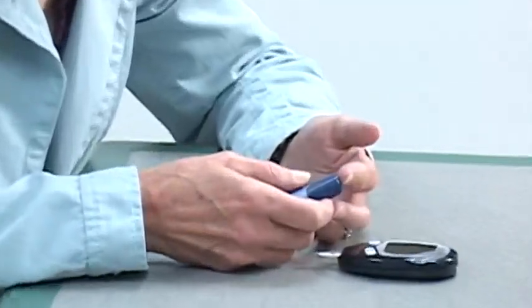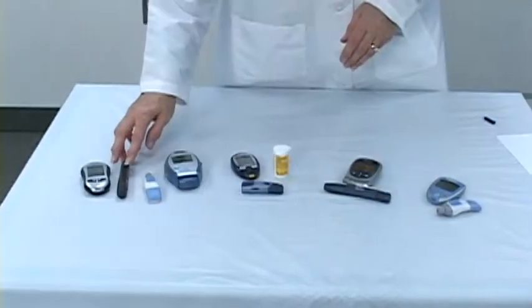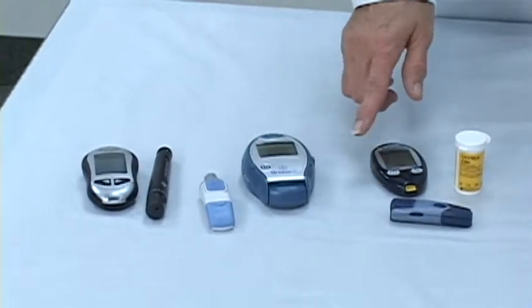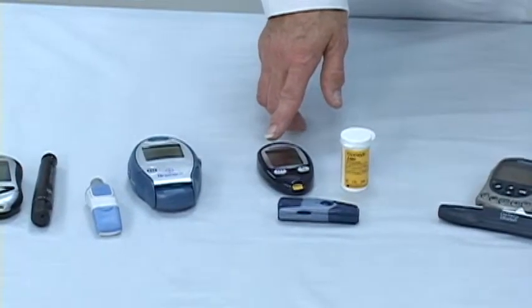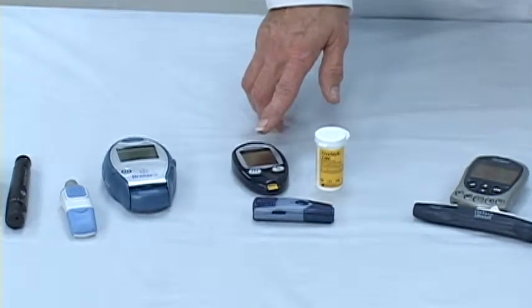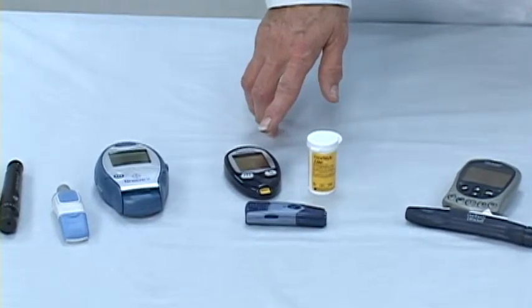It's important to take the time to make sure that you prepare your finger well to get a good blood sugar droplet for testing your blood sugar. When you got your meter, you got a lancet device. It's important to use the lancet device that came with your meter. What the lancet device does is allow you to poke your finger at the proper depth to ensure that you get a good blood droplet sample with minimal discomfort.